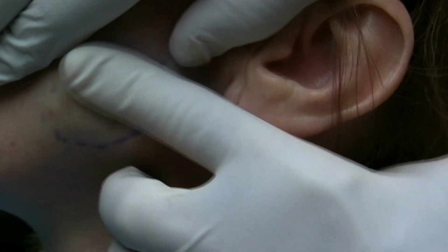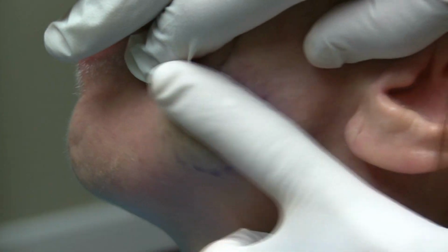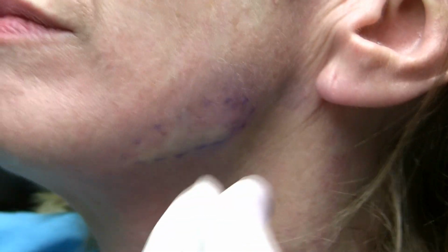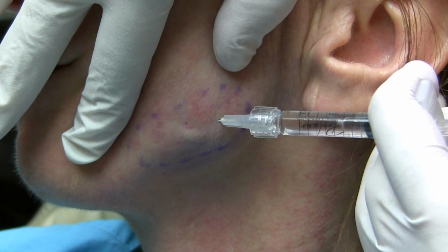But again, we are pretty much here intradermal and subcutaneous. And the massage with filler is just as important as the filler. And that's an impressive correction with one syringe. And a very impressive correction.